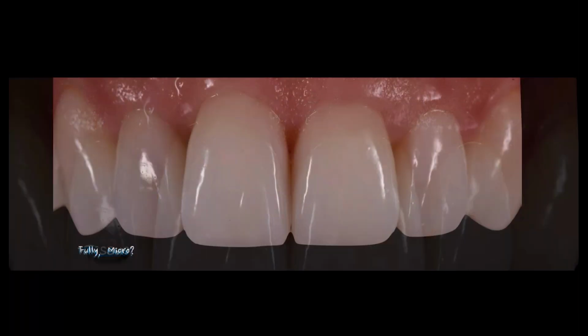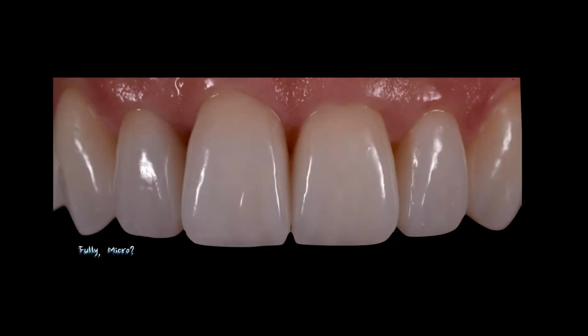Also, the depth of it plays a role, obviously. If the depth is super, super thin, meaning it's only about 2-3 tenths of a millimeter, it actually works better because the lithium disilicate is very translucent at that point. If the depth is 4 or 5 tenths of a millimeter, it's kind of difficult to keep the lithium disilicate at 2-3 tenths and only layer 2-3 tenths, but that's what we're trying to do. And then if you have more space where you have 6-7 tenths of a millimeter, then it's fine if you want to do a ceramic margin or just a very thin one and then layer over the facial. So you have a few different options on it.